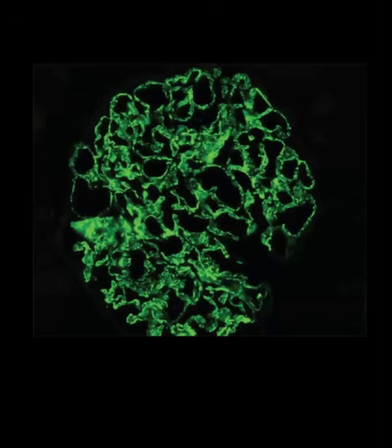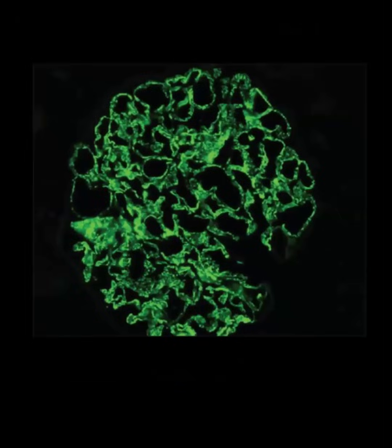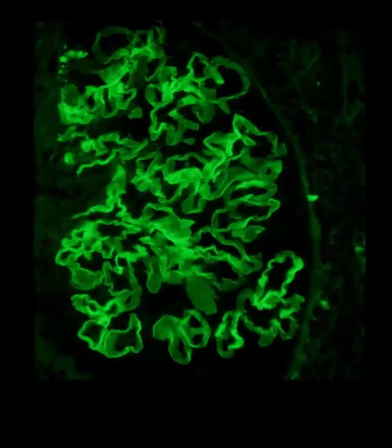Here you can see the difference between linear and granular. Whenever we have granular deposits, you can see small dots that are making a pattern. But in linear deposits, there is a complete line. You can see here there is a complete line available. So these linear deposits occur in nephrology in five places.